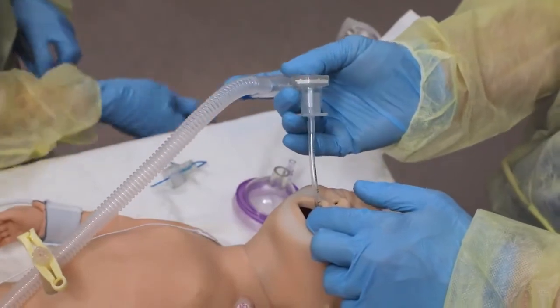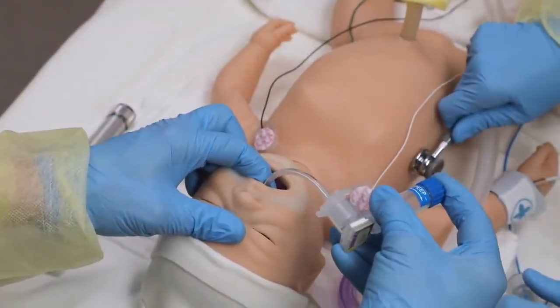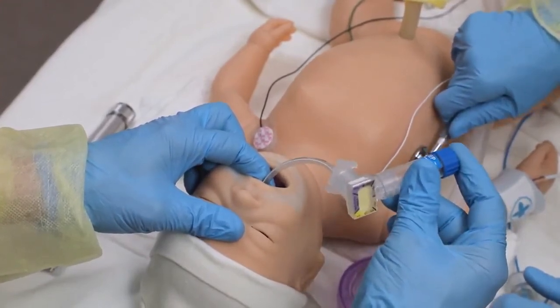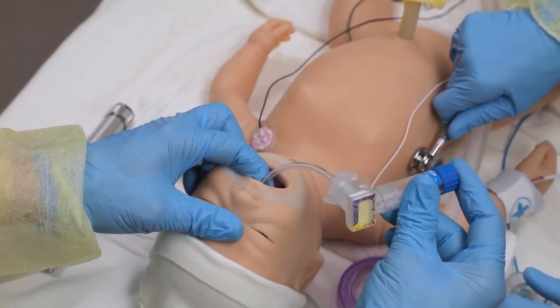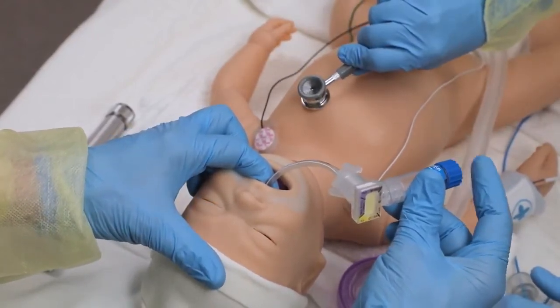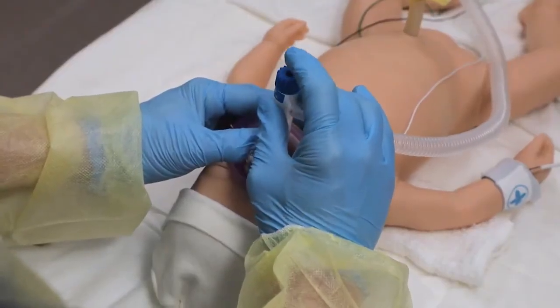The assistant listens for an increasing heart rate and bilateral breath sounds and notes symmetrical chest movement. The assistant reminds the operator to check the CO2 detector for a color change to yellow within 8 to 10 assisted breaths. Now let's demonstrate steps of the intubation procedure itself.